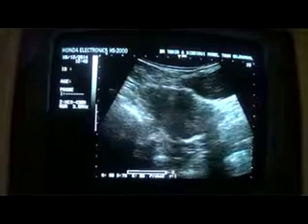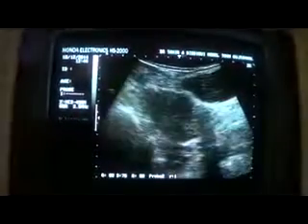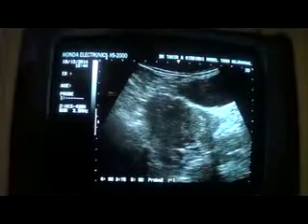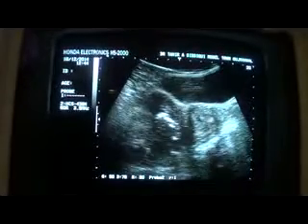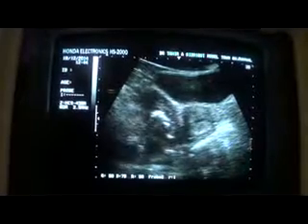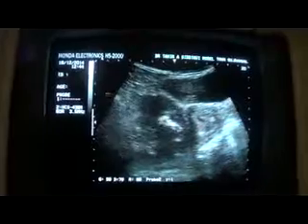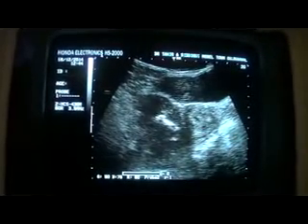where you can again make out that this is the endometrial canal, this area. This is the endometrial canal, and when I angle the probe posteriorly, I get this hypoechoic area with multiple internal echogenic areas within it.